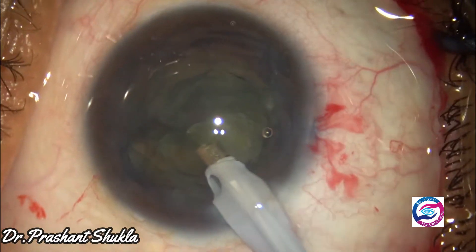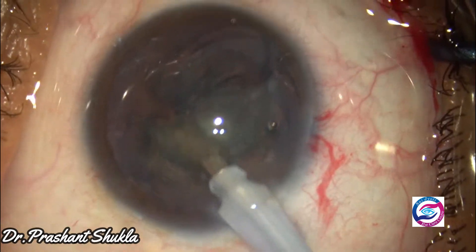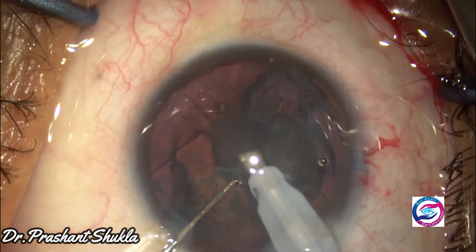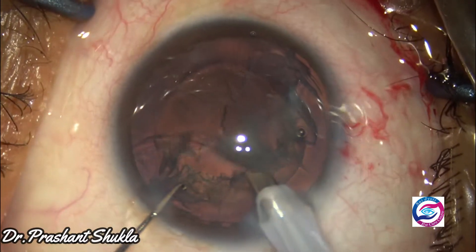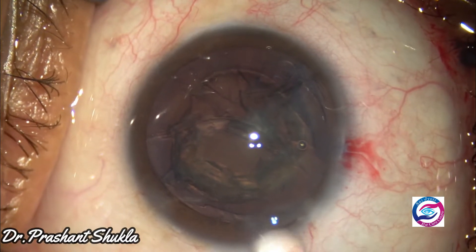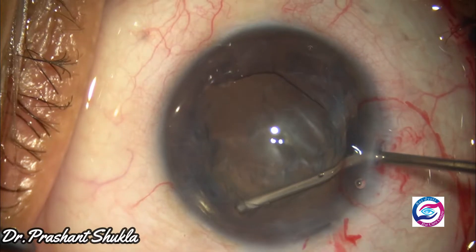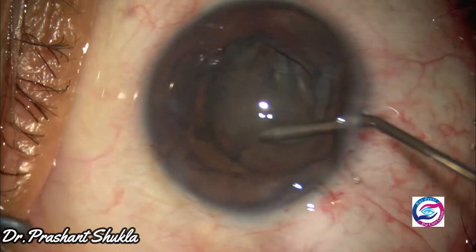As the cataract was soft, it was relatively easy to emulsify the nucleus and the epinucleus as a whole. The sub-incisional epinucleus could not be mobilized using the FACO handpiece, so here I am doing a viscodissection with the help of HPMC so that the sub-incisional epinucleus could be brought to the center and then comfortably removed.